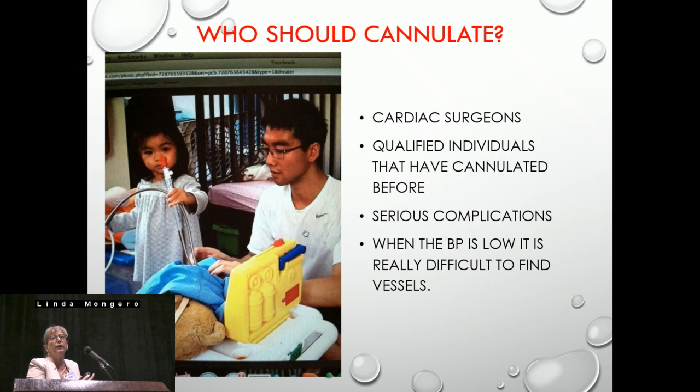So who should cannulate? So this is really controversial. This is what one of our anesthesia residents did. He said he was going to a hospital that was going to be doing a lot of ECMO. So he said, Linda, can I just come and spend some time in the OR with the perfusion? I said, sure, absolutely, no problem. And every day, he was always digging into things. And we had a couple of cannulas that were open and not used. And I said, here, why don't you take these cannulas with you, and you can use them at your new hospital for your teaching tool when you start developing ECMO in your unit.